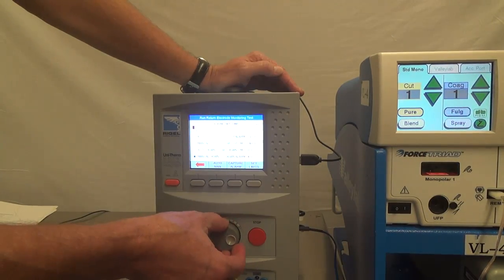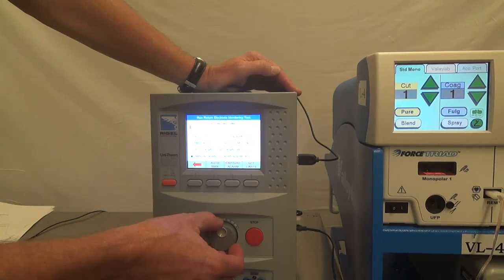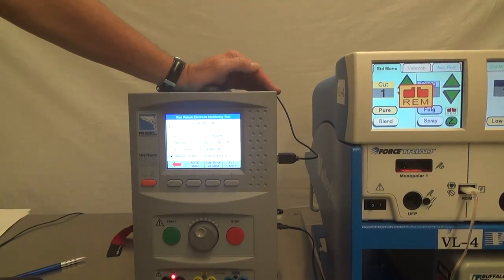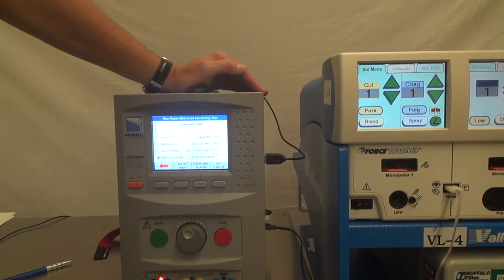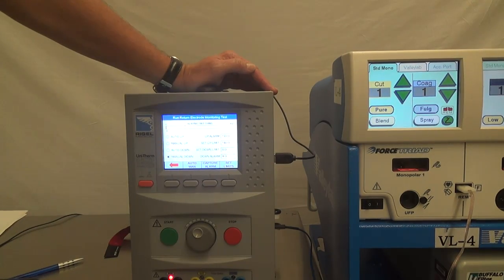You hear the alarm when you go to 4, but you also note that the REM tab alarm lights red, like that. So you hear the alarm, you see the visual, you know it's working. There you have it, you've completed the REM check of your ForceTriad.